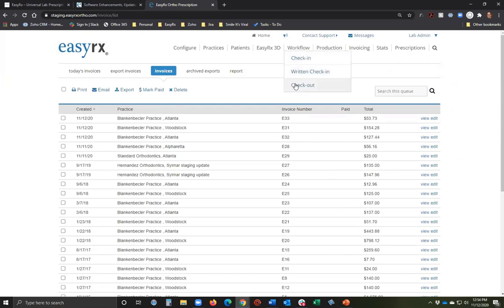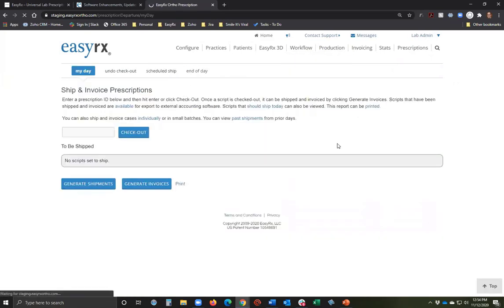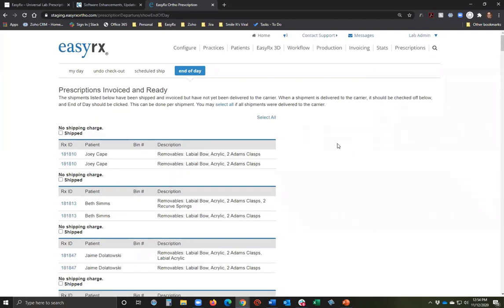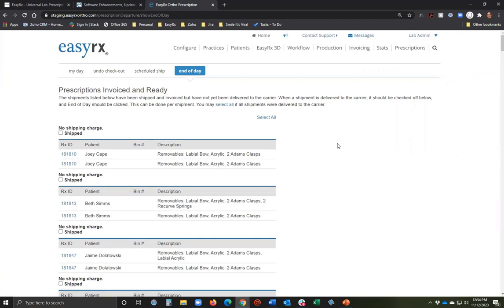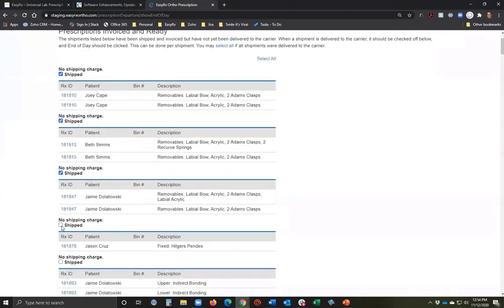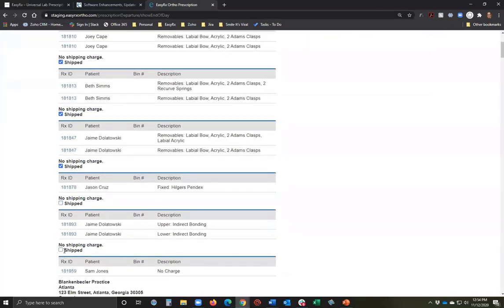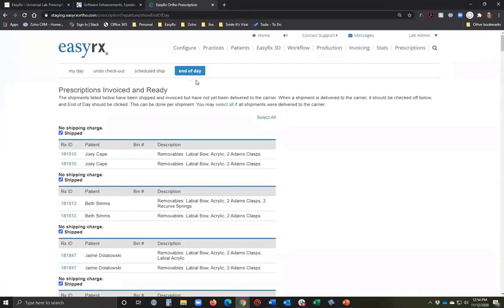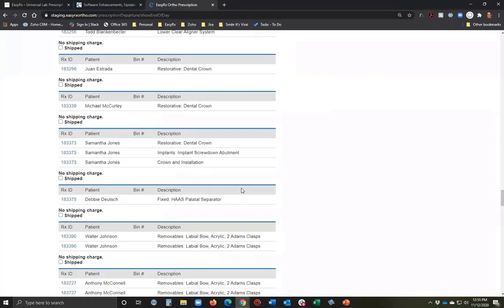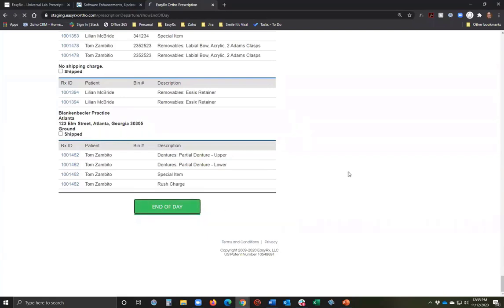The final thing to show here is 'End of Day.' Many labs will invoice and then ship the next day. We have an 'End of Day' interface where you can go through all invoiced cases and mark them as shipped once they're in the mail or picked up by UPS. This makes it easy to batch-process shipped status after all invoicing is complete.